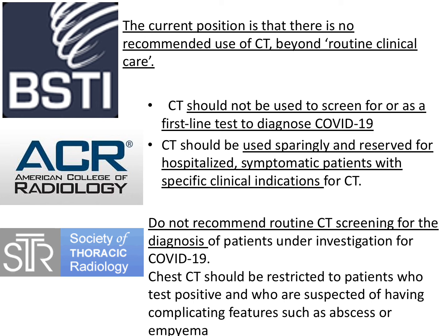Remember that in patients with COVID-19, up to 30% of hospitalized patients will have pulmonary emboli. So when there's disproportionate symptoms and a CT is required, we should consider doing CT pulmonary arteriography.